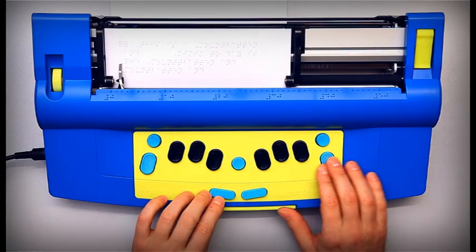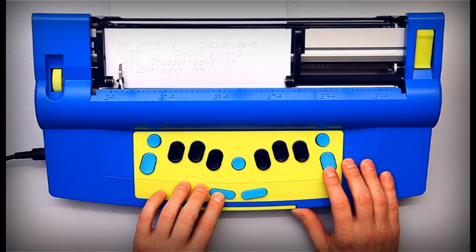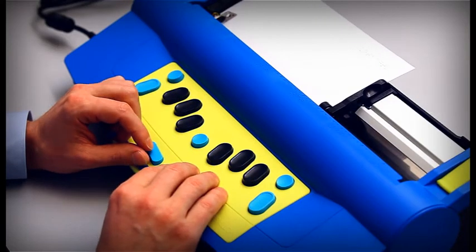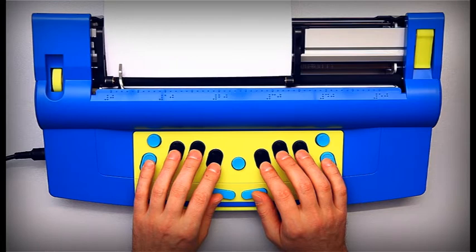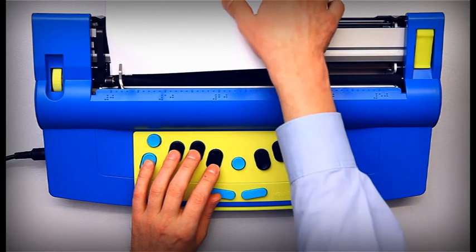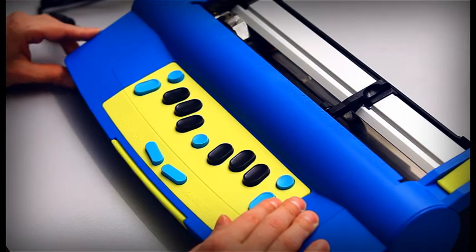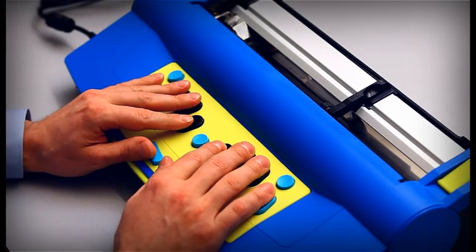When your work is done, your Mountbatten will eject the paper for you after you press New Line and Enter. Switch your Mountbatten off to conserve the battery so that the unit is ready when you need it next time.